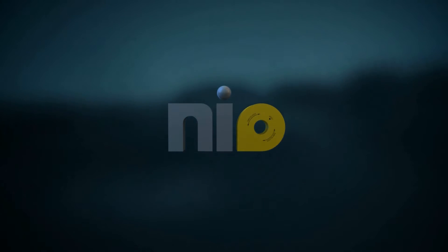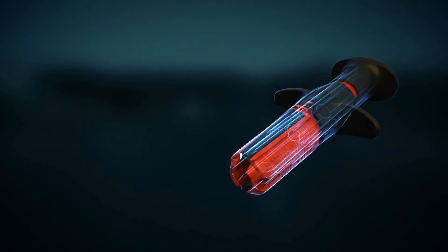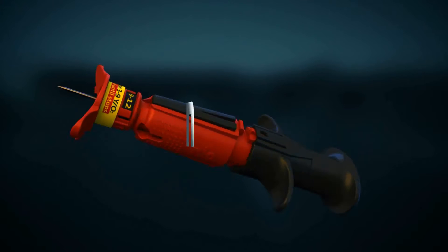NIO Pediatric, a ready-to-use automatic intraosseous device for safe, quick and easy vascular access. NIO, life-saving innovation by Persis Medical.